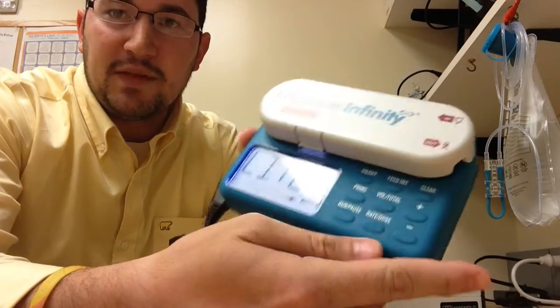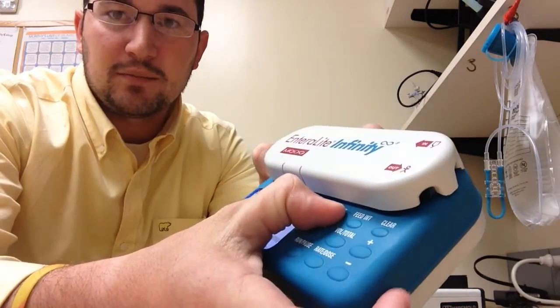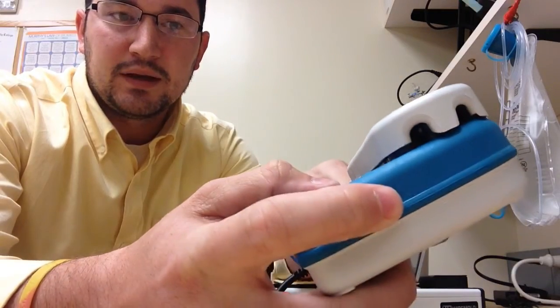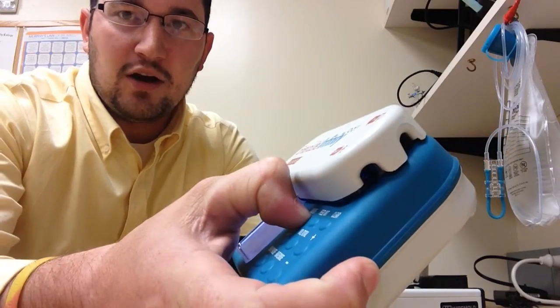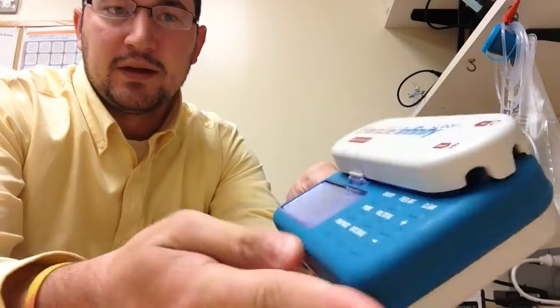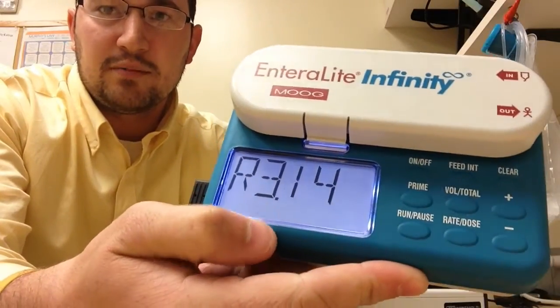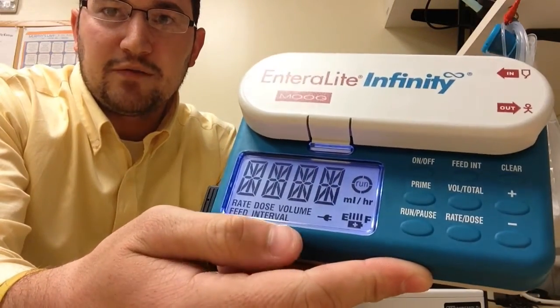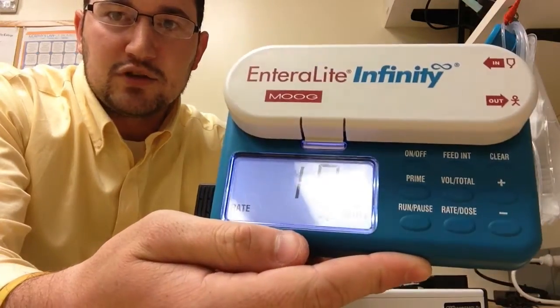So once you're finished updating your settings, you just want to turn the pump back off and turn it back on. The pump scrolls through serial number, information, and then it comes on.